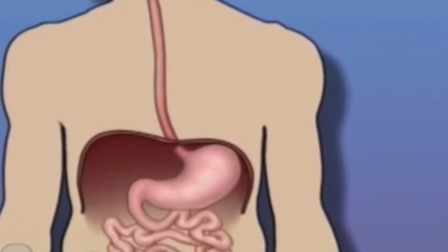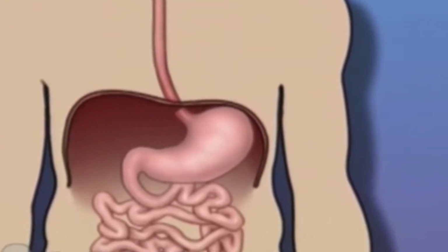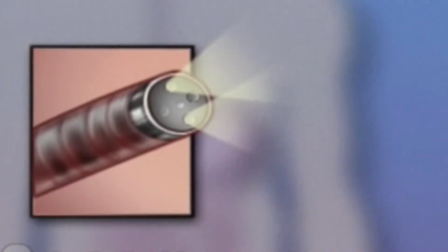During a medical procedure, a doctor will pass a flexible tube, called an endoscope, into a body orifice. This has a tiny video camera mounted onto its tip along with a small light, applied for better visibility. It can also contain a small tool for taking tissue samples or performing small surgeries.